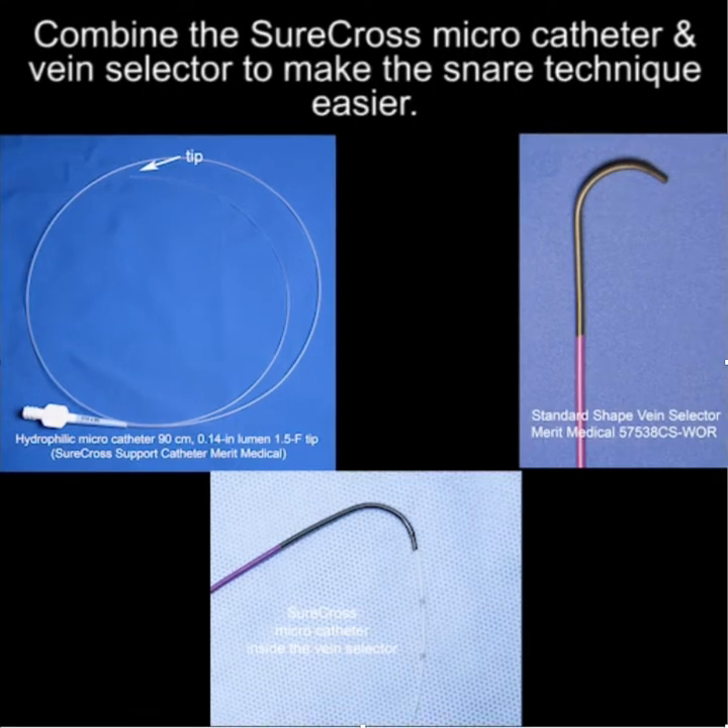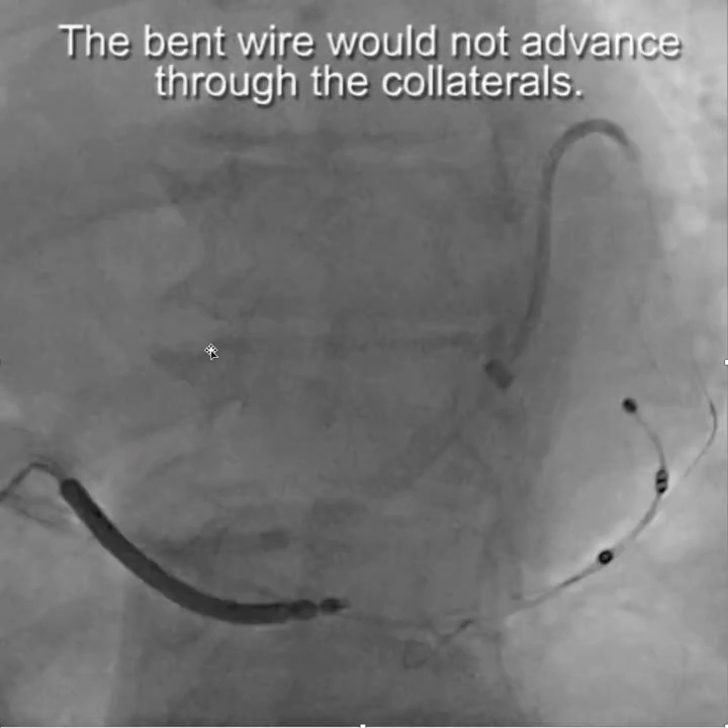For the snare folks out there, you can combine the SureCross microcatheter inside the vein selector to make the snare technique easier, and this is the SureCross.